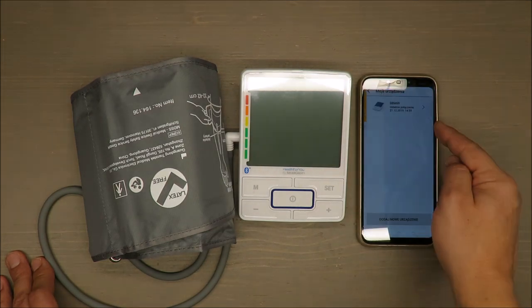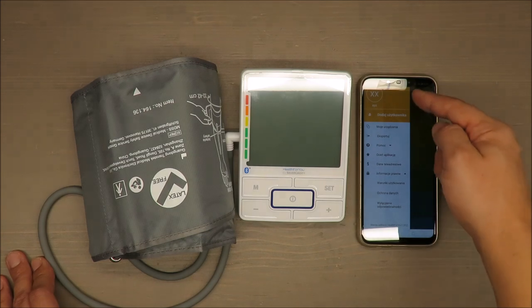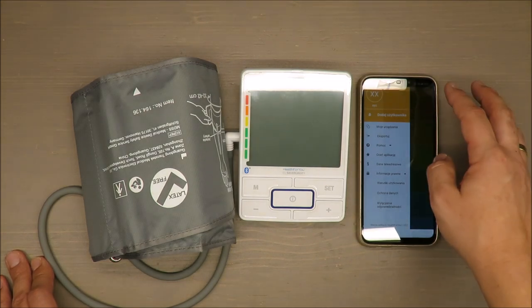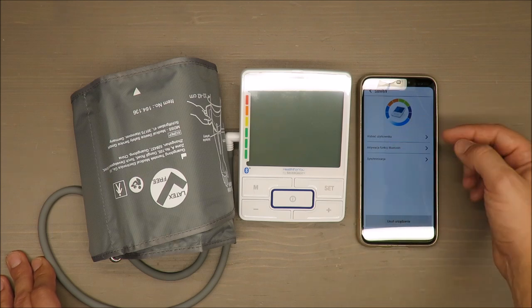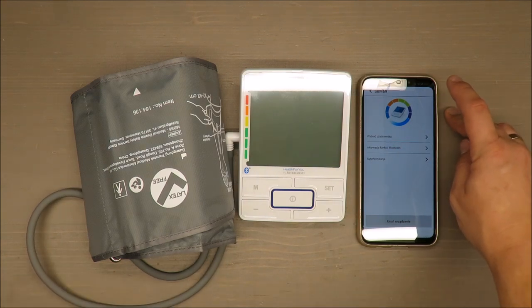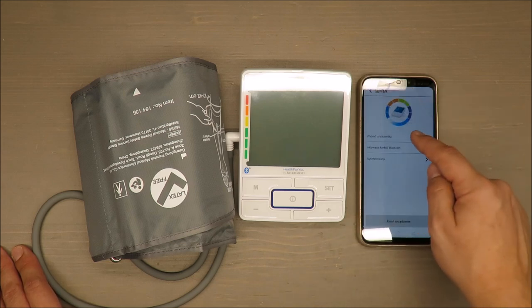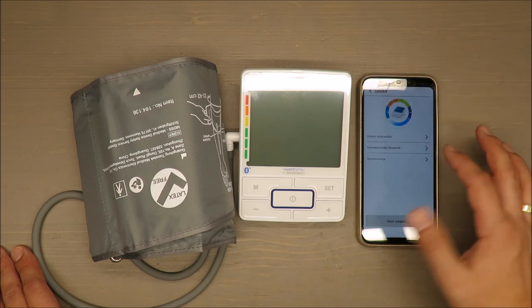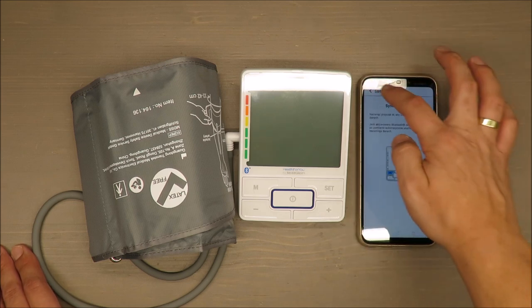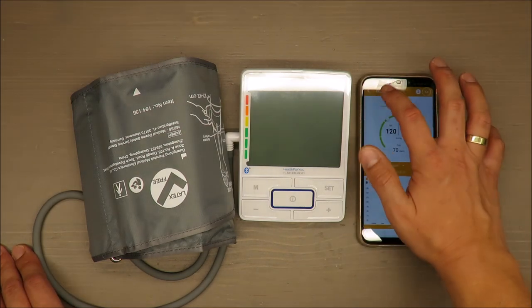If you want to manage your device, just click the pop-up menu in the top left corner, my devices, and you have really basic information: how to choose a user, how to activate Bluetooth easily, just follow the instructions, and how to synchronize. Easy and user friendly, I would say.